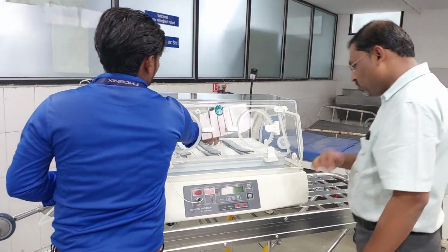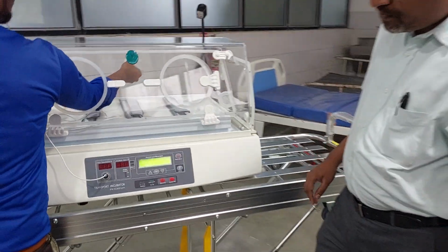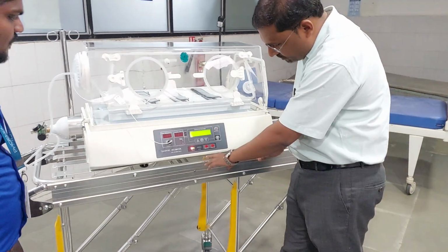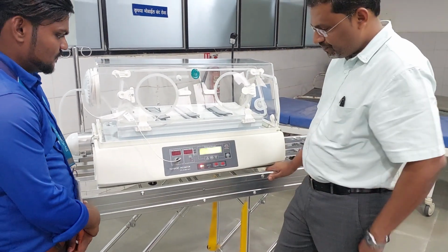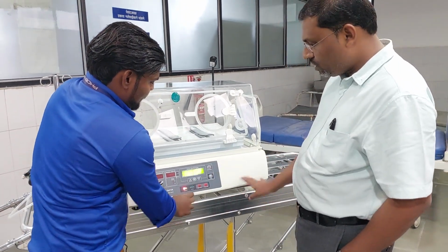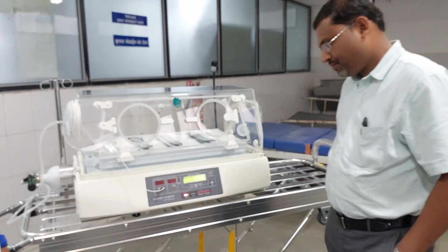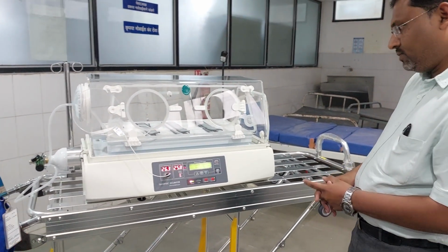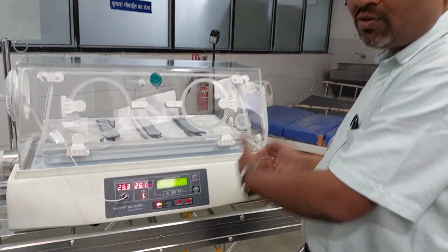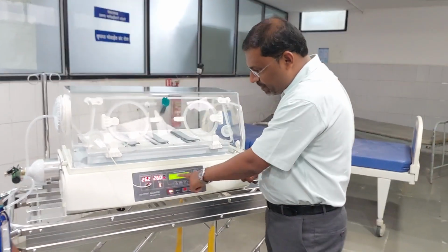Now I am going to switch on the warmer. Now it will operate on the battery. Once it is switched on, see, now it operates on battery. Now it is in standby mode. It will not give you any output. Now we have to give it power. Why is it giving an alarm? AC power fail, because we have not given an AC supply. That's why it has given the AC power fail alarm. Now it also shows low temperature and so on.